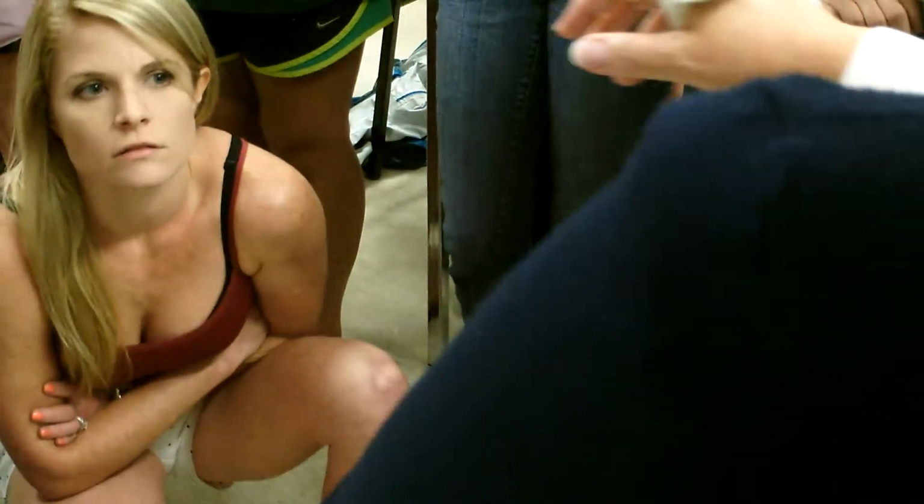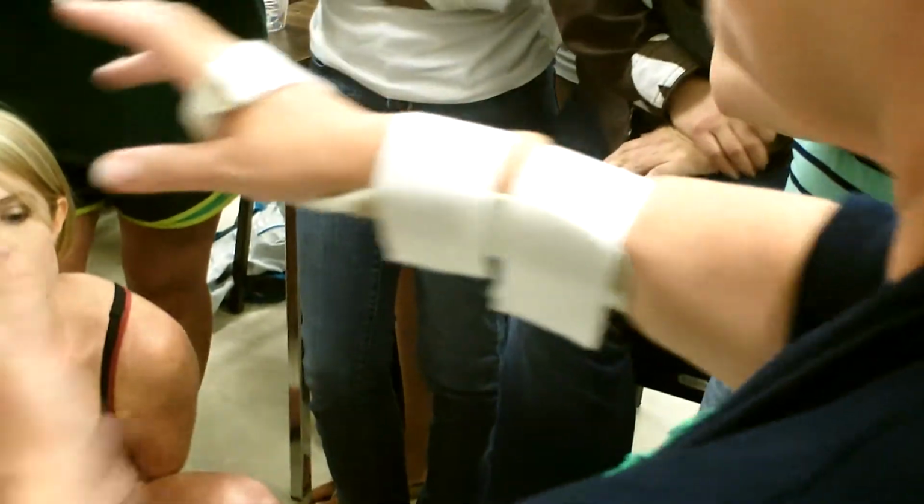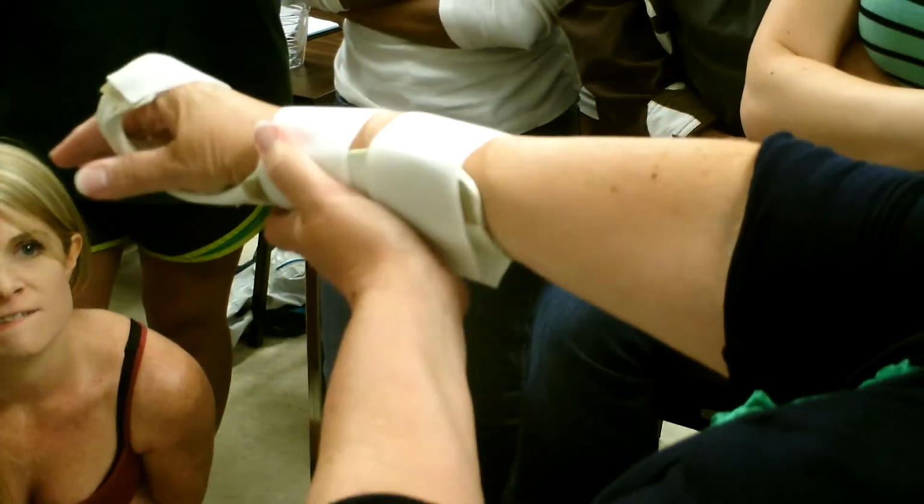Could you pad the arm just in case? You could pad. I'm not a padder. Costs more money though, because my theory is if you make a good splint, you shouldn't have to pad it. That's my theory. That's just a theory. That's not scientifically proven. We all have beliefs.